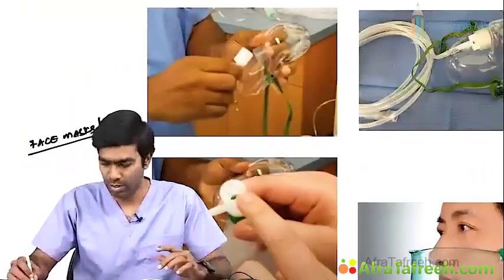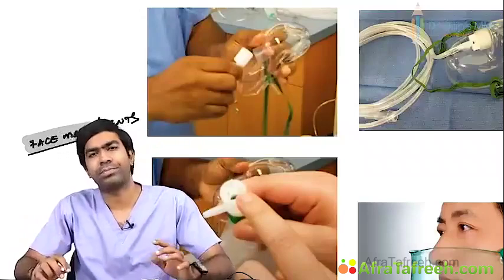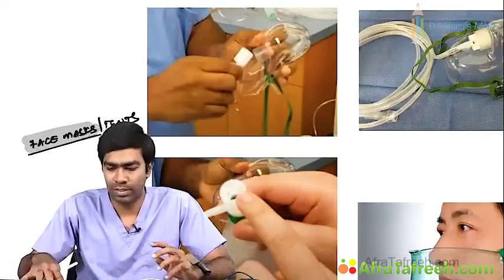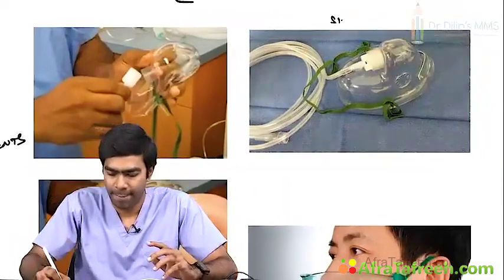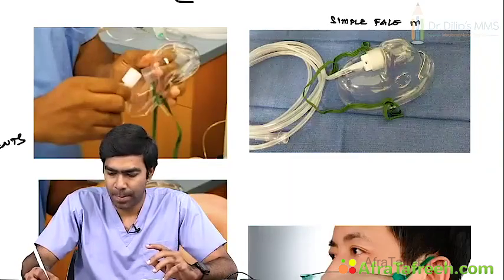We will move on to the face masks. Face masks, clear? So among face mask devices, first obviously is the simple face mask.